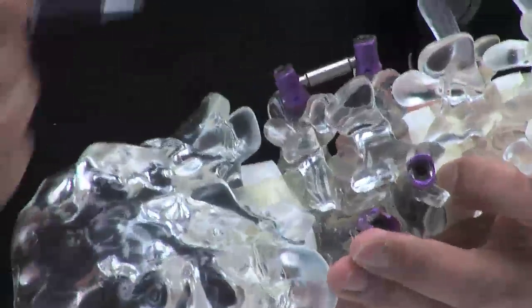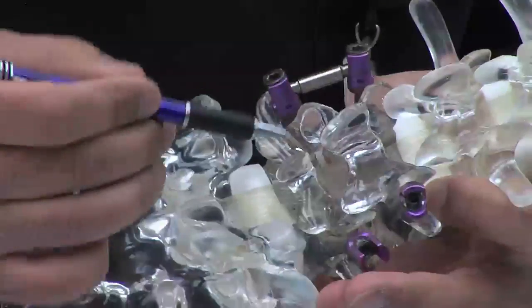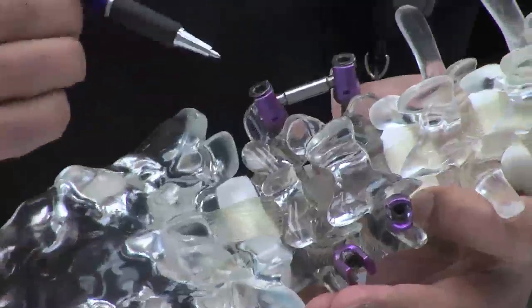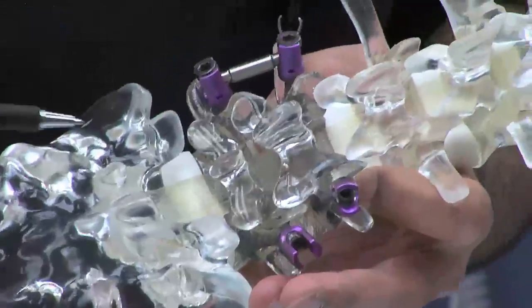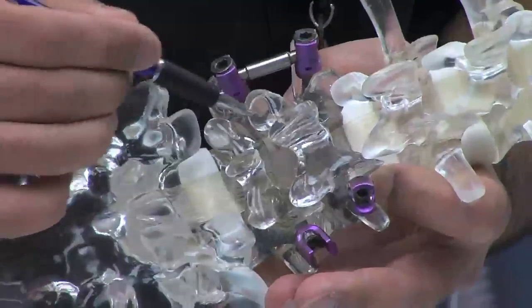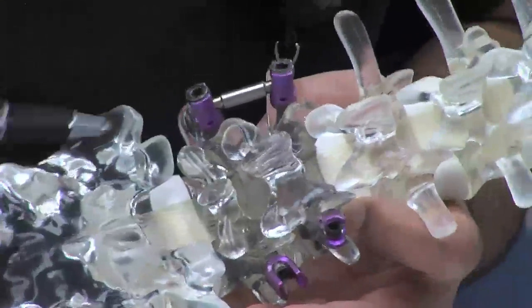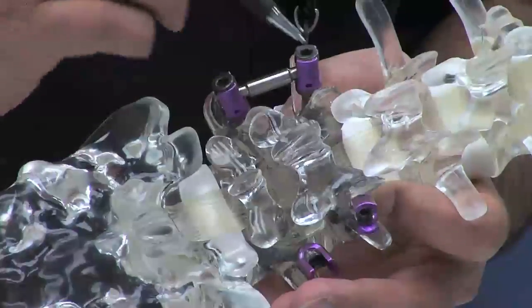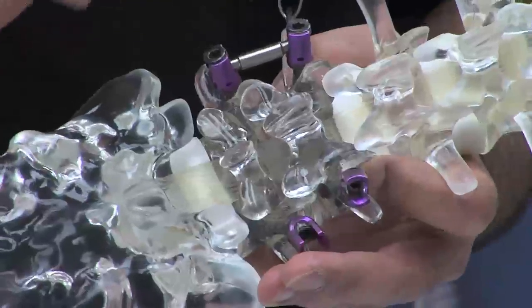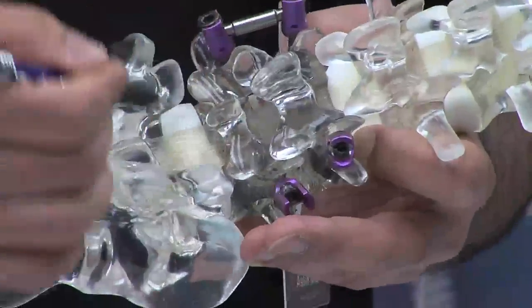Now, of course, the most important part of the surgery is the fusion. What that is, is we get the local bone, we morselize it, and we lay it down between the two bones. Now, within the next 5 to 6 months, that will turn into a solid bone. Therefore, the two bones will turn into one bone, and that is the surgery. And if that doesn't happen, the screws will eventually fail and get loose. Therefore, we have to do the surgery all over again.